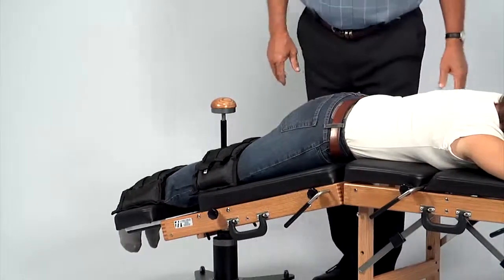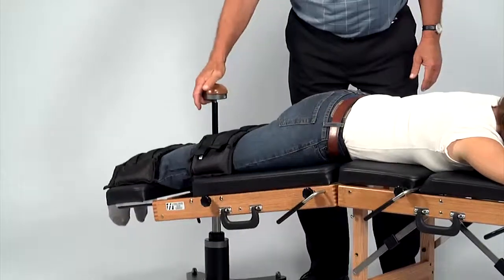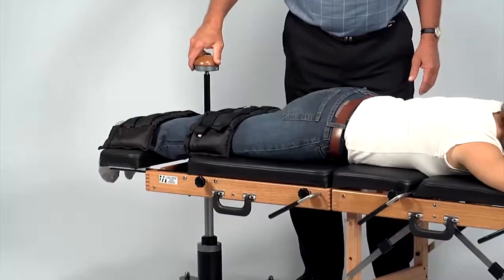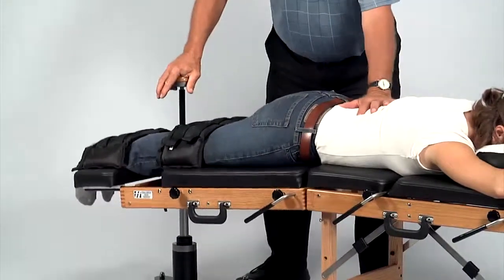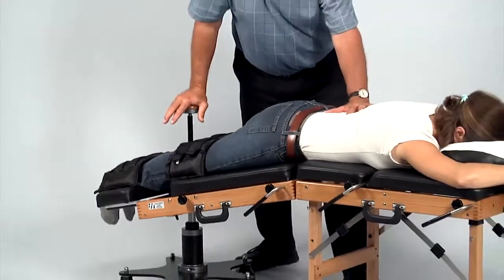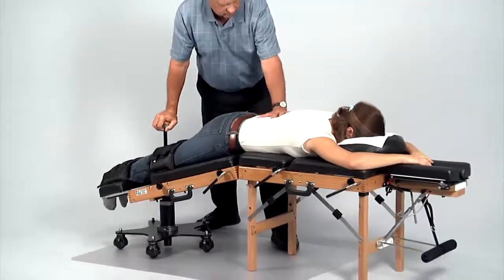He may resume flexing the table by returning the button to the red position. The flexion distraction device is an innovative and versatile addition to any chiropractic practice.